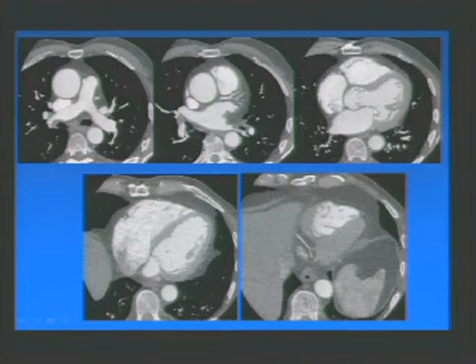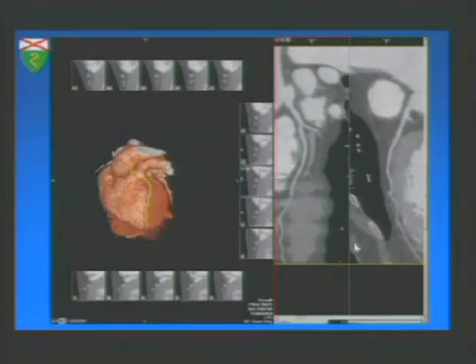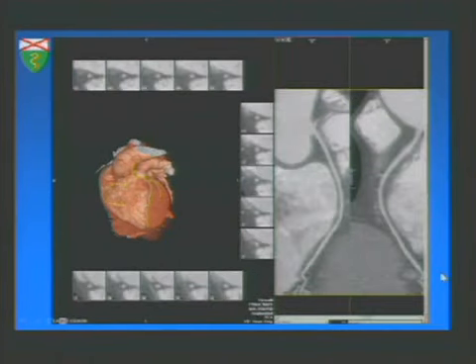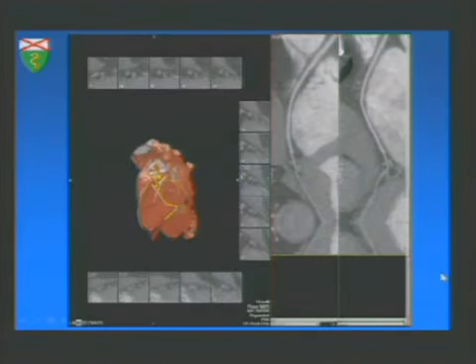You see the left main, proximal LAD, the right coronary, no streak artifact, and all the way to the bottom, end of the RCA, beginning of the PDA. Those are reformatted images. You have the LAD straightened out there, the circumflex, the RCA, and also the PDA in the bottom of the heart was well opacified, no motion.